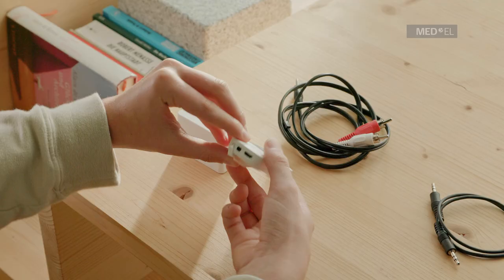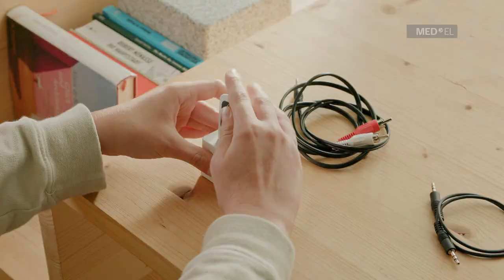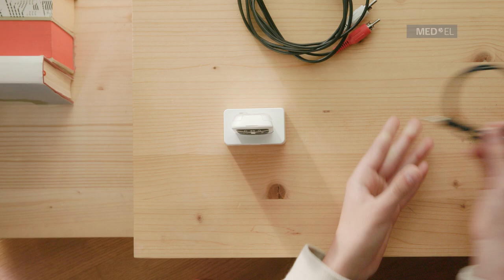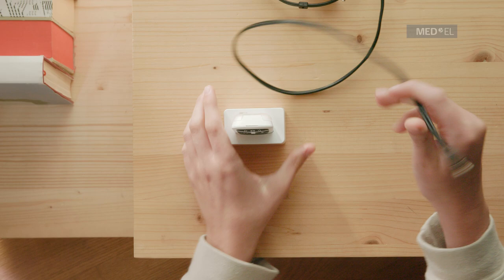Connect the docking station to your TV using the provided cables. Use the audio cable for exclusive use, or the RCA cable if you wish to listen with others. Make sure the TV connection is set to output. Please note that different TVs may require different cables. Switch on your TV to start streaming.